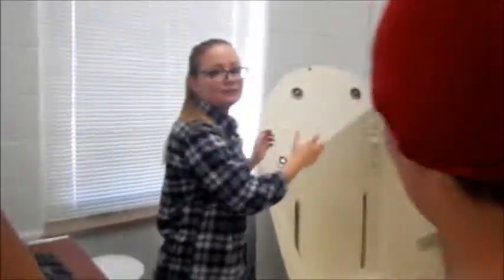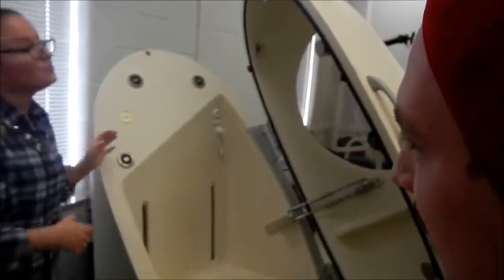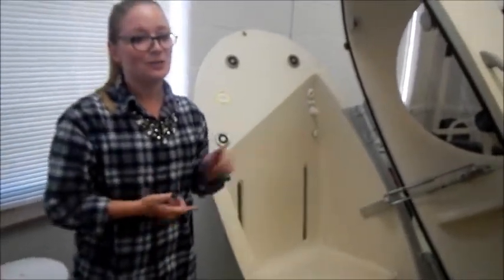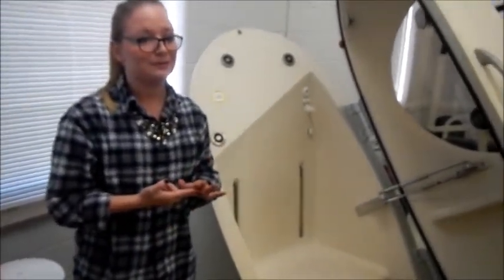Prepping the subject for the bod pod. A swim cap is used to minimize air displacement by the subject's hair. While in the bod pod, the patient is instructed not to breathe too hard, talk or laugh, and to try to minimize movement.